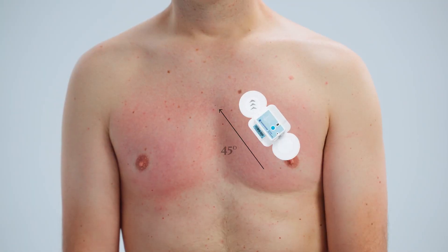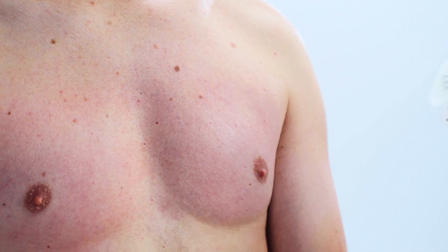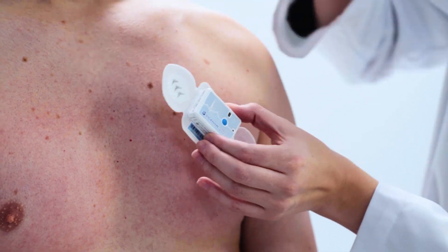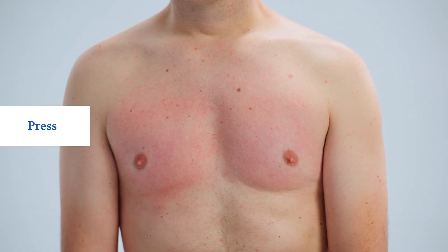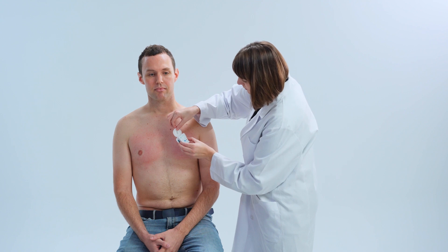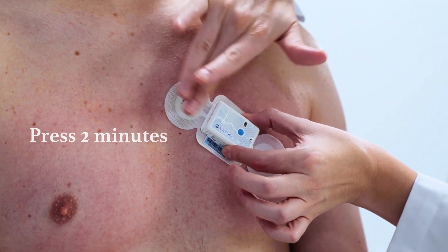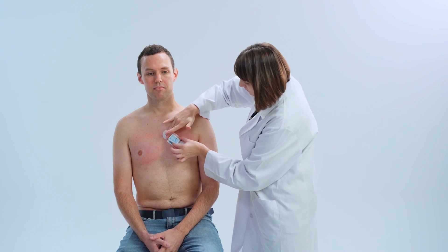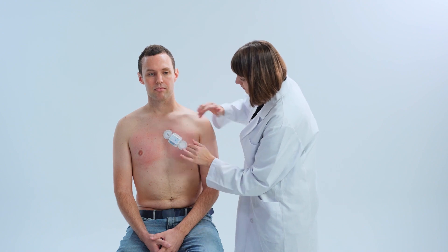Hold the device diagonally at a 45-degree angle with the arrows pointing upward. Now you're ready to attach the device. Confirm the target zone on the left chest. Remove the paper backing. Be careful not to touch the electrodes and the adhesive. Press the entire patch firmly for two minutes. Smooth out any bubbles or wrinkles underneath. A good press means good recording because the electrodes have good contact to the skin.